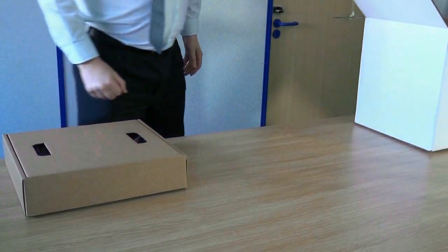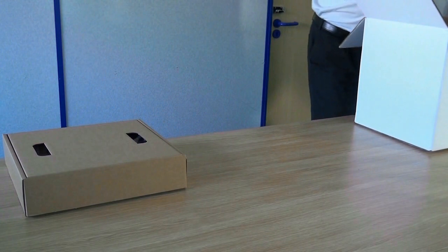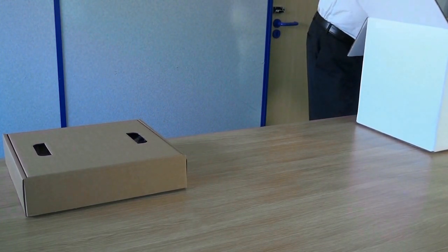When unboxing the Sonicade Team 3 Fetal Monitor, the unit is below the Accessories box.